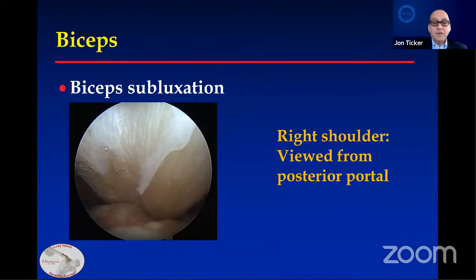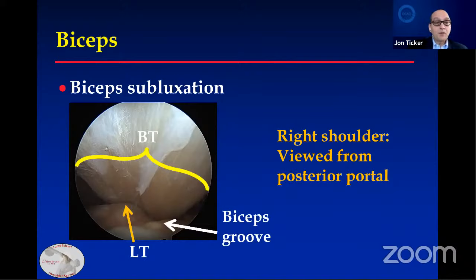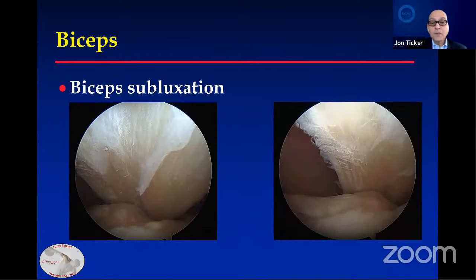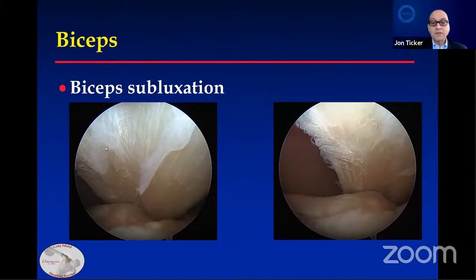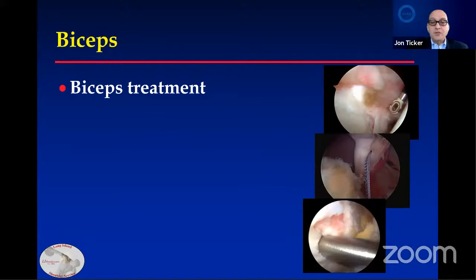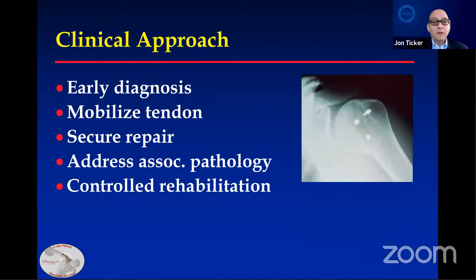This is a subluxed biceps in a right shoulder viewed from the posterior portal. You can see the edge of the lesser tuberosity, the biceps groove is pointed out, and the flattened, widened biceps tendon wearing on the bone. The same patient a little more medially — it can sublux because there's no subscapularis. You do have to take care of the biceps and treat it early, then move on to the subscapularis. There are times where I'll do a tenotomy or a tenodesis, depending upon the patient and the preoperative discussion.